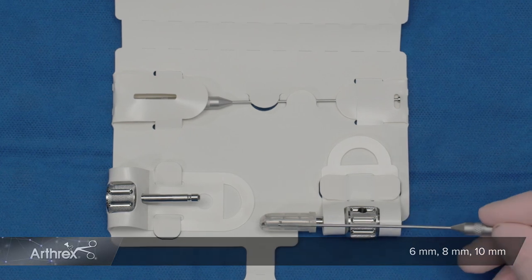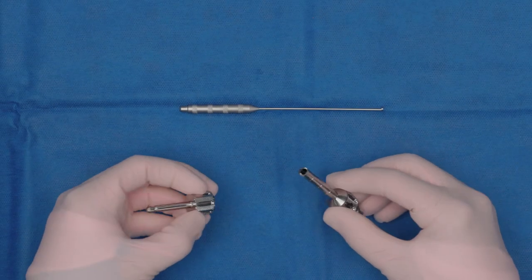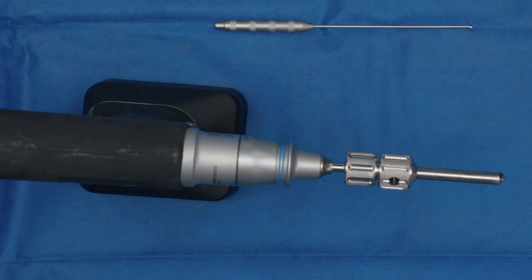This cutting tip morselizes the bone as it's drilling, and that size is consistent with cancellous chips. Now that the components are out of the package, we assemble them. You take the AO quick connect, connect it to the auger, and then easily connect that to an AO drill.